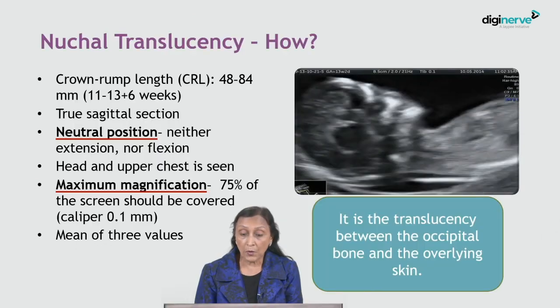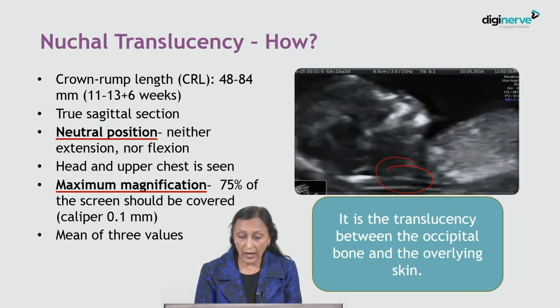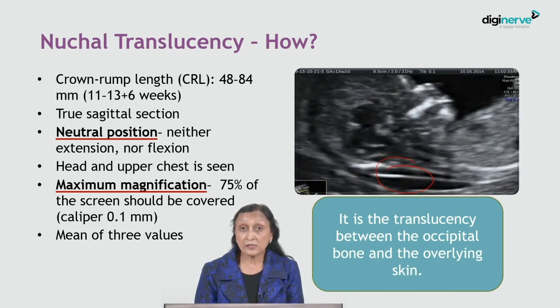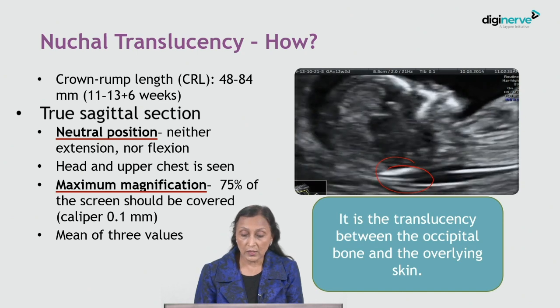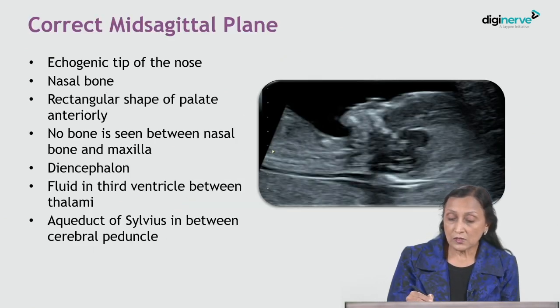It is very important to understand that we are measuring the translucency — the black part between the occipital bone and the overlying skin — and the skin is not included in the measurement. To confirm it is a true midsagittal section, you must see the nasal tip, the skin of the nose, and the nasal bone.